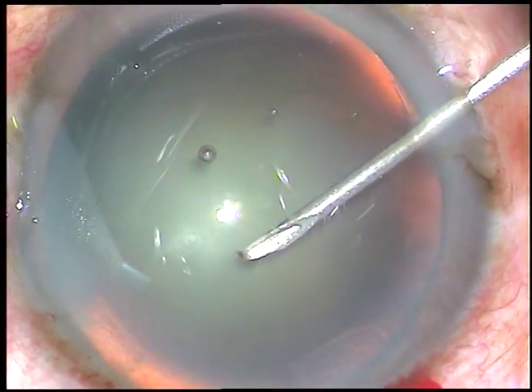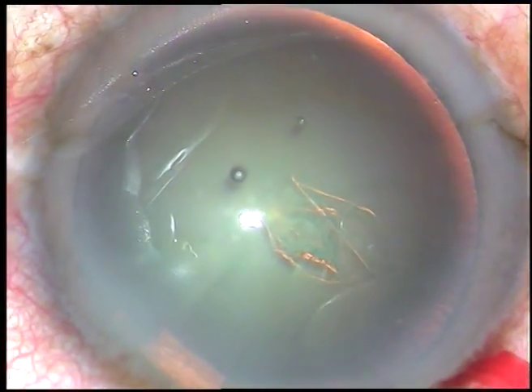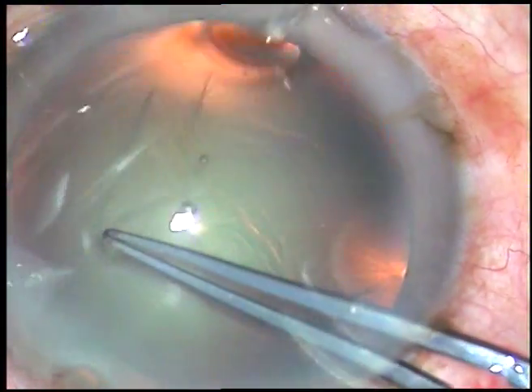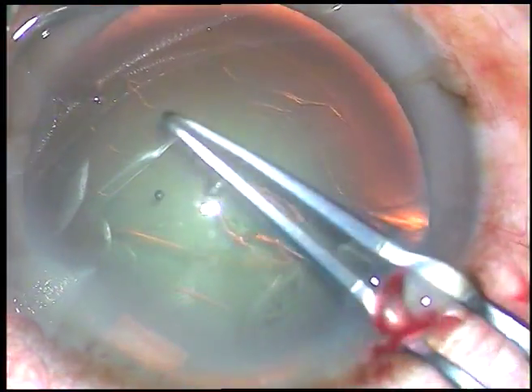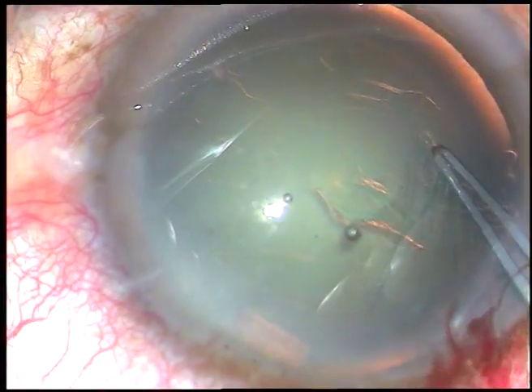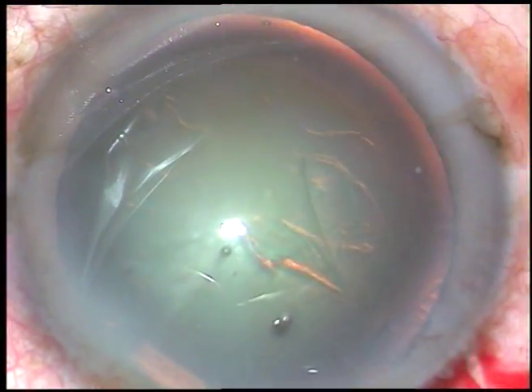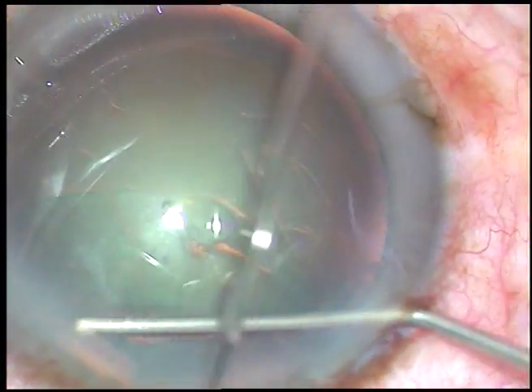And now capsulorhexis. The capsule has been incised with a 26-gauge bent needle. Now I hold this capsular tag with utrata forceps, go anti-clockwise. I am remaining at equal distance all around from the margin of the dilated pupil and thus I get a round rhexis. The pupillary margin, if the pupil is round and dilated, the pupillary margin is your rhexis guide.